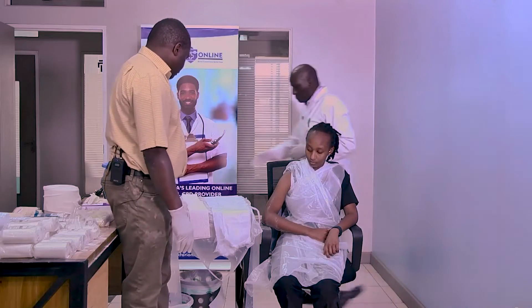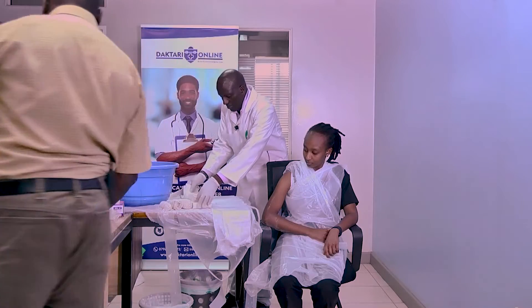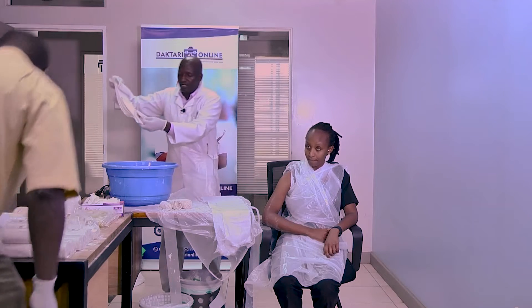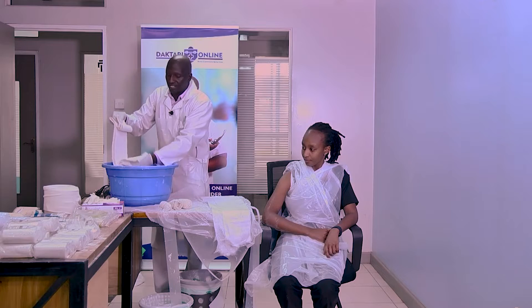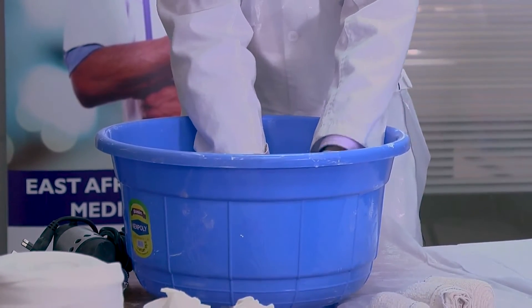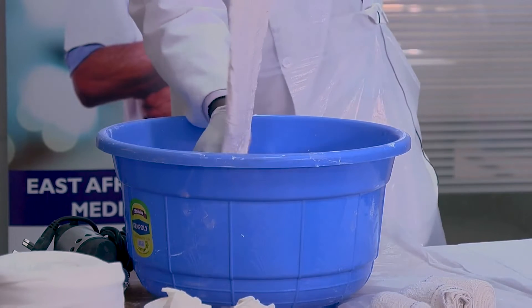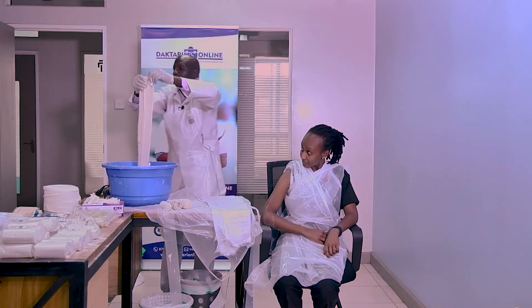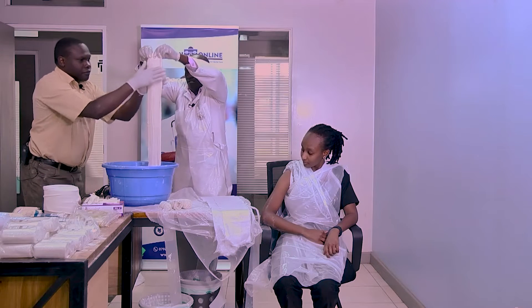So we want now to dip our slab into the water. Remember always how we normally dip — at 45 degrees. Then you allow the bubbles to come out, 2, 4, 5. Squeeze it, but don't squeeze too much. Because we are two, allow both hands — you can see you can do that.